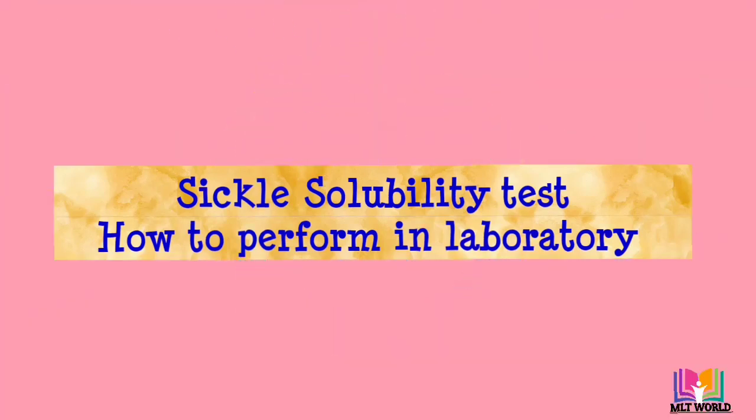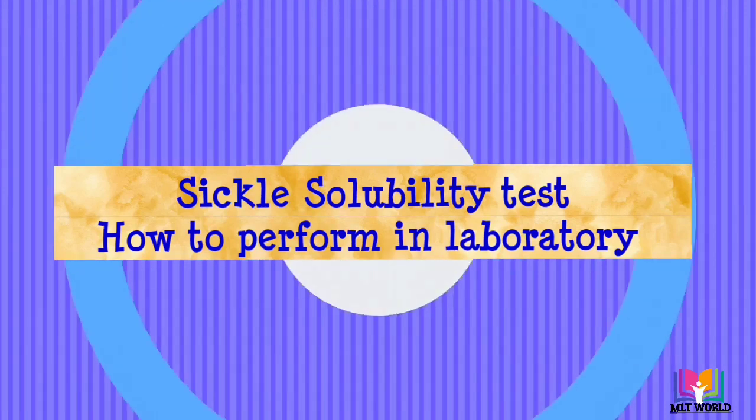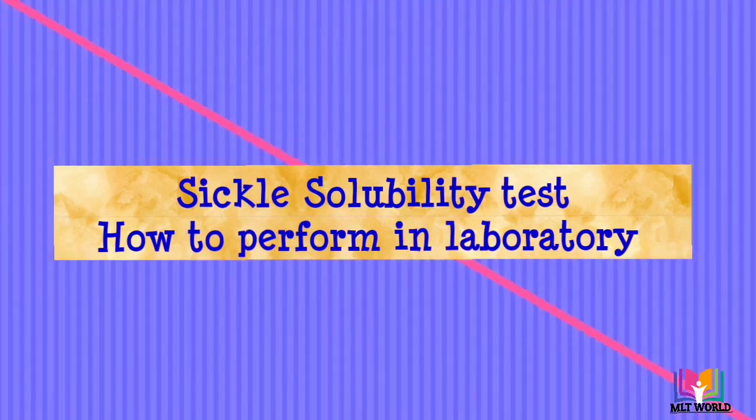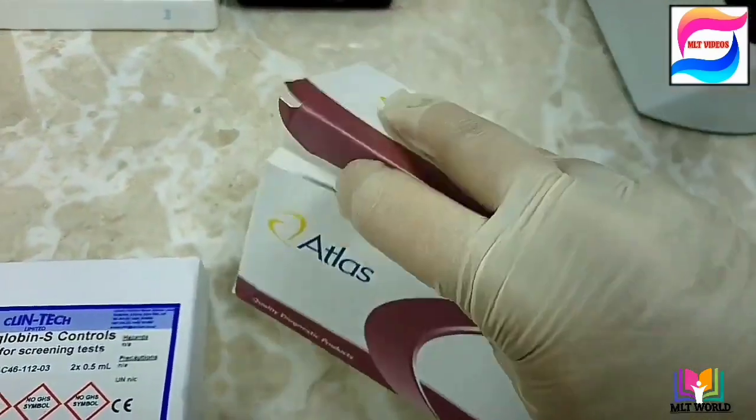Welcome back friends. Today in this video we will see how to perform the sickling test, or sickle solubility test. This test is needed to detect abnormal red cells — sickle cells — which are sickle or crescent shaped.